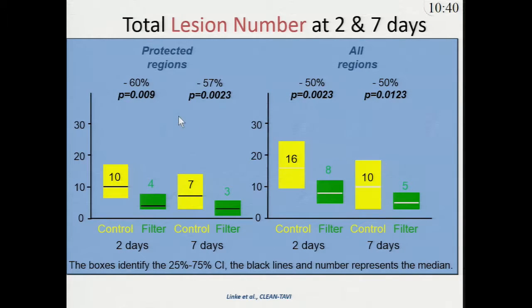These are patients where only the protected regions were evaluated. On this side, all regions available have been evaluated. You can still see that the difference has become a little bit smaller, but it's still highly significant between 2 days and 7 days.